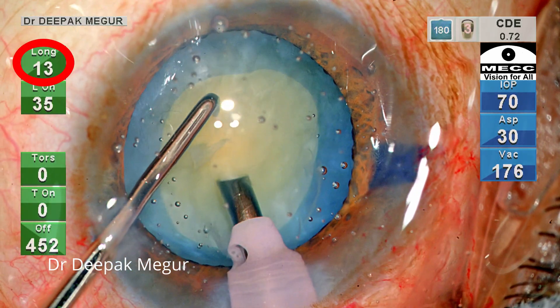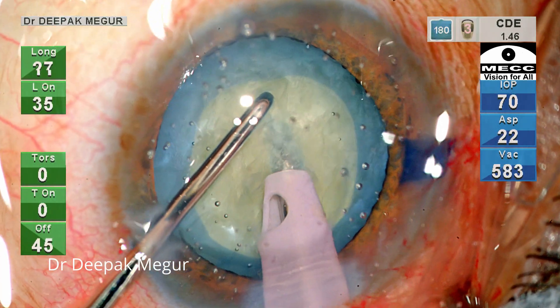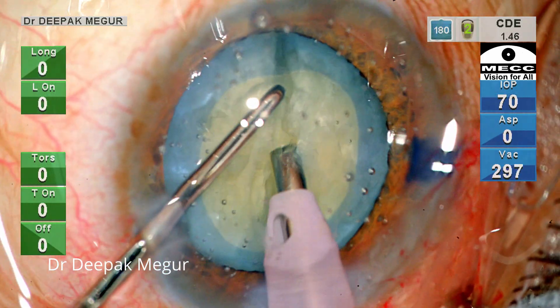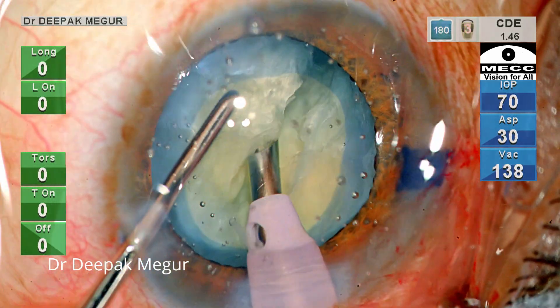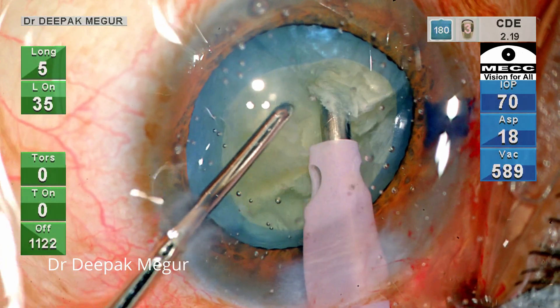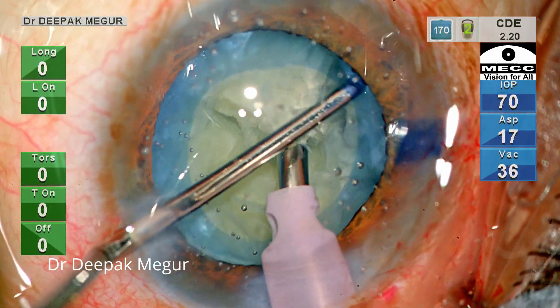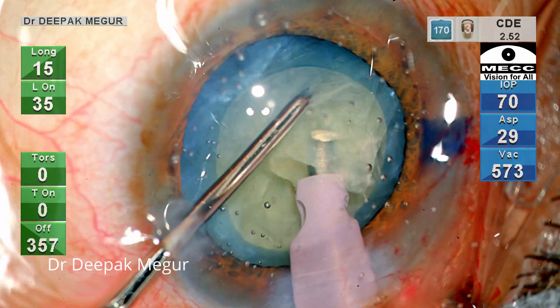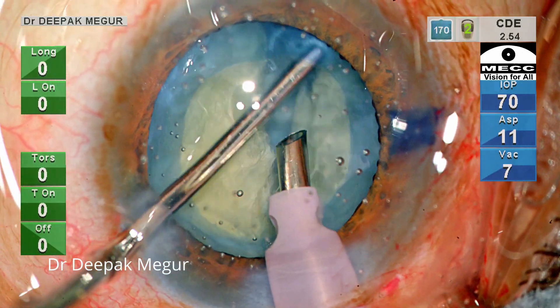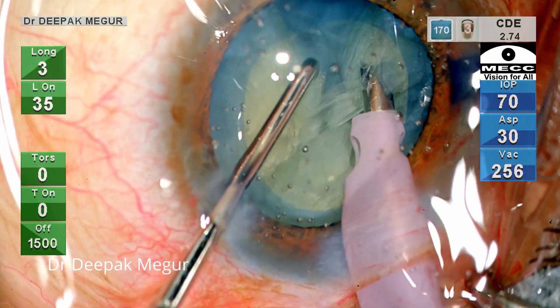I bury my phaco tip using longitudinal phaco energy. The chopper is placed in front of it, goes down, and then laterally separates. During lateral separation, you can see that at no point is the chopper tugging at the margin of the rhexis. The lateral separation movement just stops short of the chopper touching the rhexis margin. The key point during lateral separation is to avoid bringing the chopper very much lateral anywhere near the vicinity of the rhexis margin.